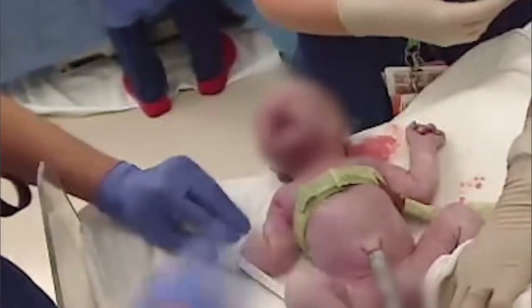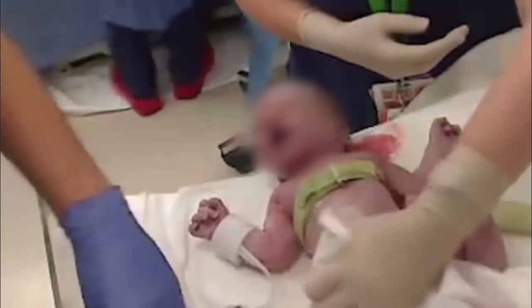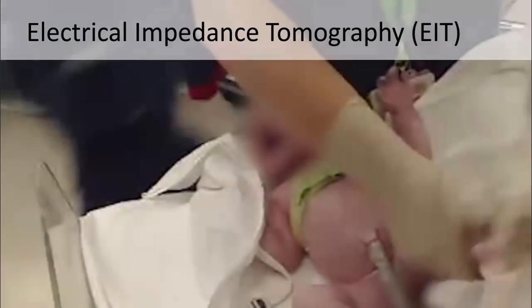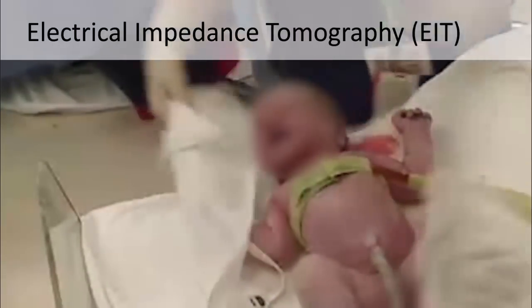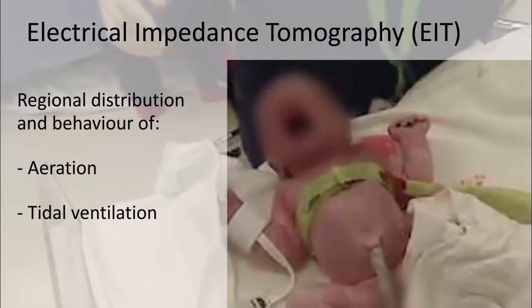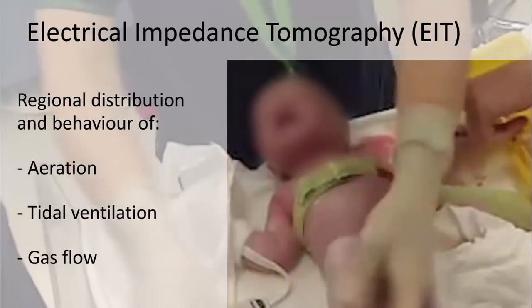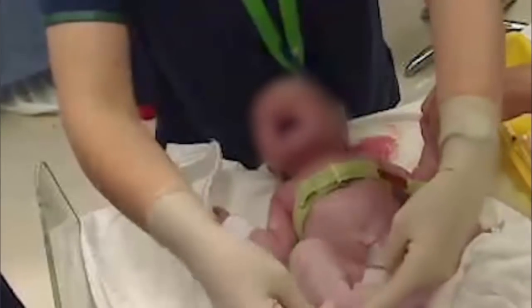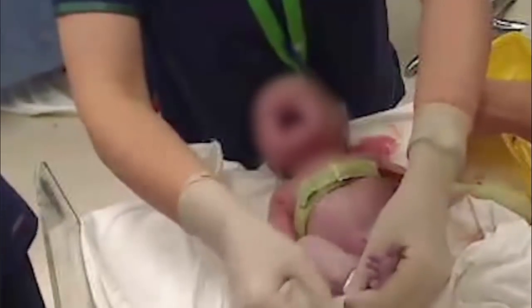We imaged healthy term neonates born by elective caesarean section from their very first breath after birth using electrical impedance tomography or EIT. EIT allows the real-time visualization of the regional distribution and behavior of aeration, tidal ventilation and gas flow within the chest. EIT is ideally suited to neonates as it is non-invasive and radiation free.